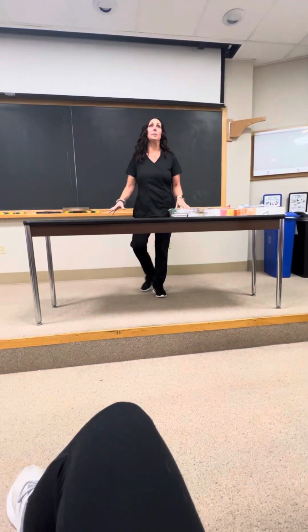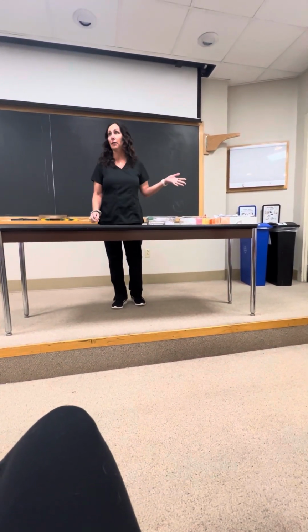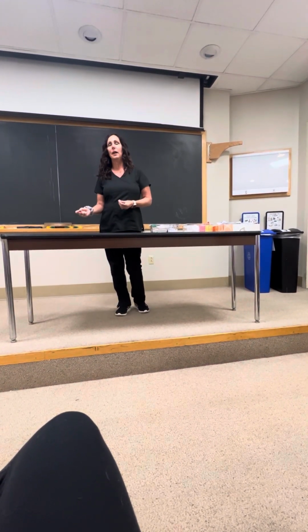I'm a physician assistant, but also Senior Director of Clinical Field Operations for Isto Biologics. So you all have the Magellan cell concentration device here, and there's a couple of surgeons who are concentrating bone marrow aspirate to saturate bone grafts with perfusion. Just a little quick overview of why they're doing this.